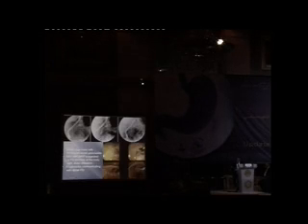For the interest of time, I'm not going to show video images, although they are available for anyone who wants them, but I'm going to show still images. Next is the recurrent acute pancreatitis due to either stones, stricture, rupture, or pancreas divisum. For all these problems, ERCP is the best modality to solve them.